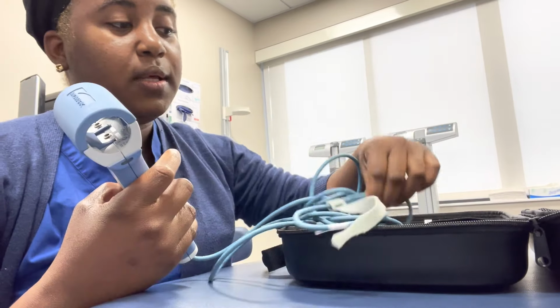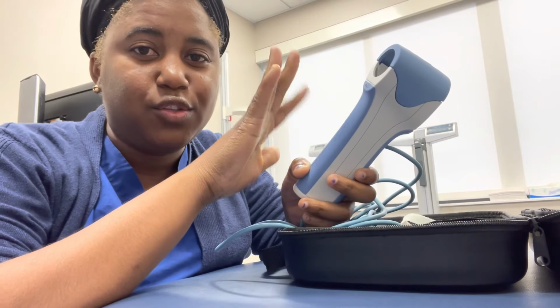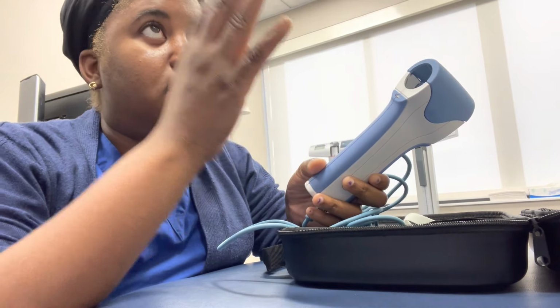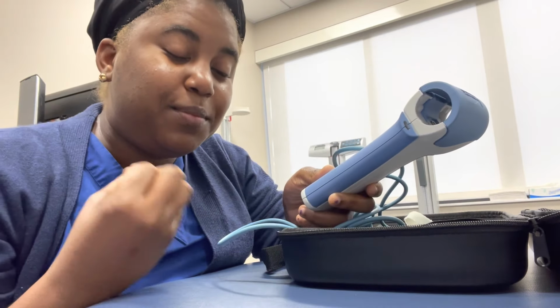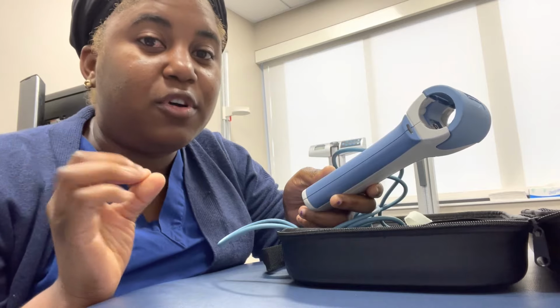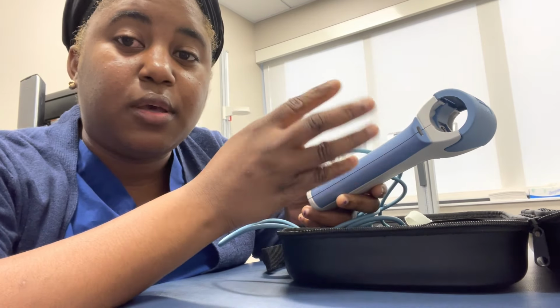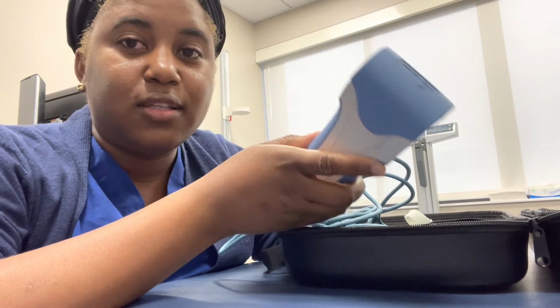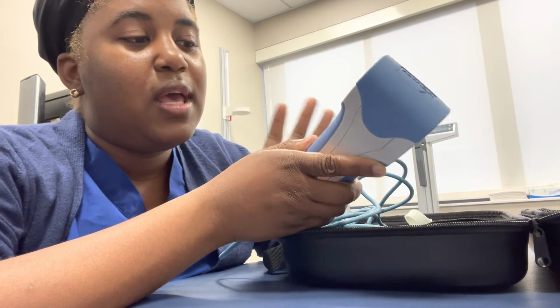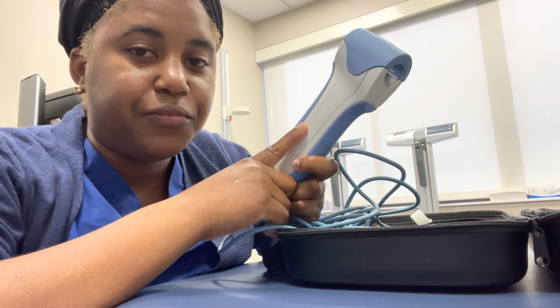So when we plug it up to the computer, there will be a bunch of candles. The patient's supposed to take a deep breath and blow for as long as they can. So what we do is we turn the computer screen around to the candles so they can see the candles being blown out. And this is done 3 times.